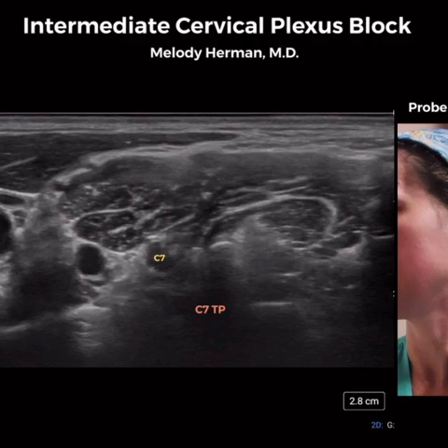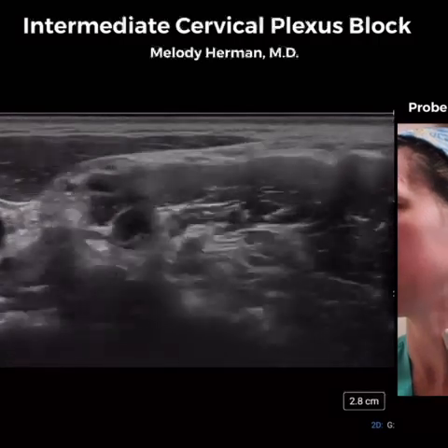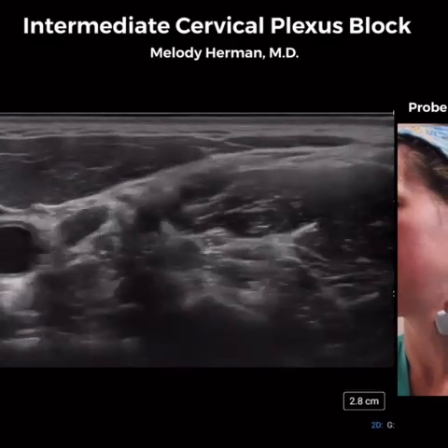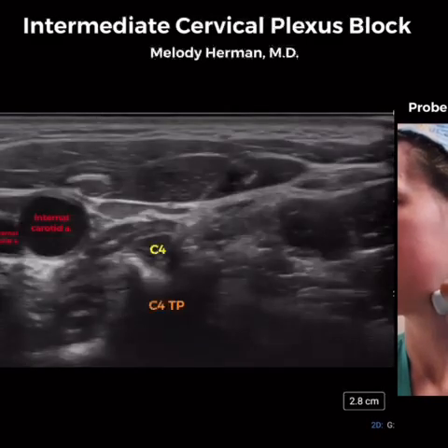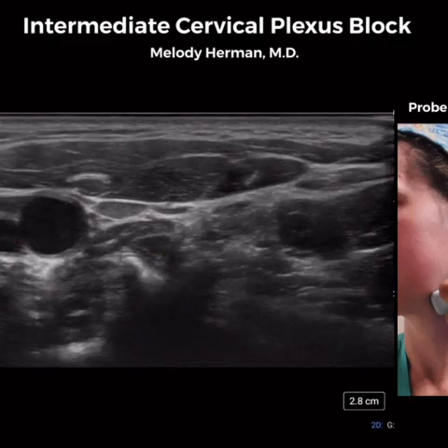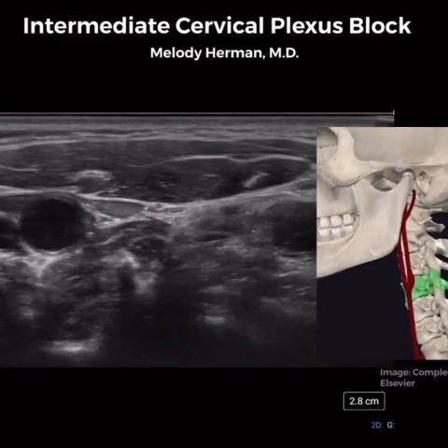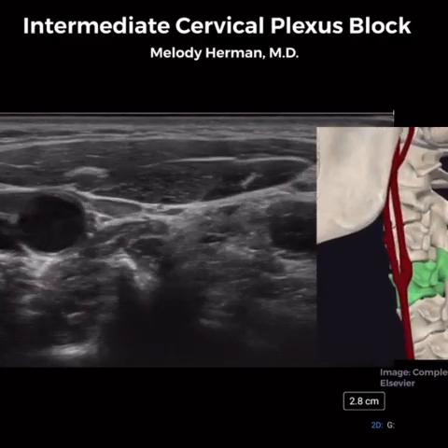As we scan cephalad at the neck, we can see the shadow of each transverse process come into view — it sort of looks like a teacup. We see each nerve root dive into its respective transverse process. When we arrive at the C4 level, notice that the carotid artery bifurcates. We can therefore use the bifurcation of the carotid artery to approximate the C4 level.